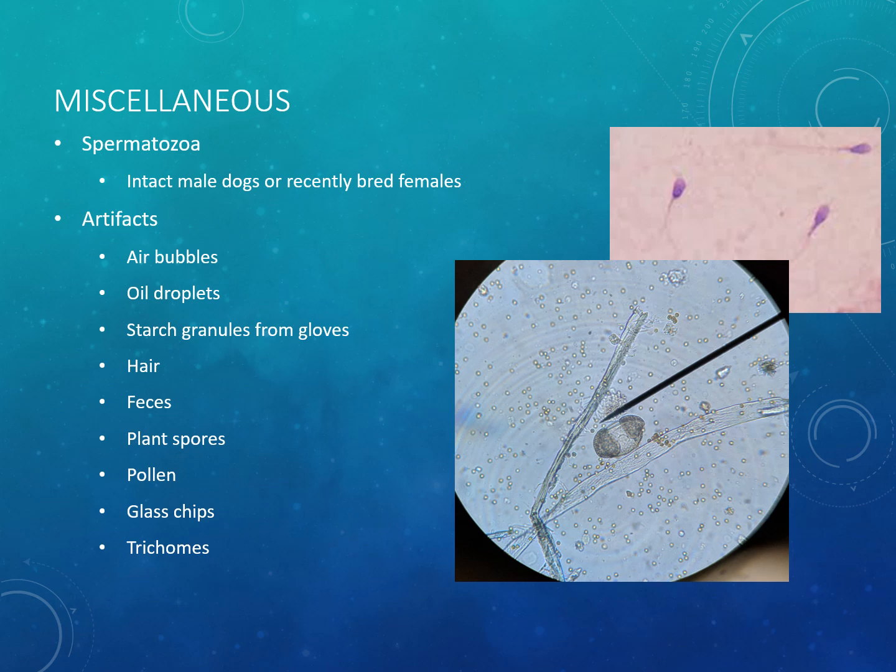Pollen, if you look right here, we have some sperm. We have some fibers, possibly fabric. We have some plant material here. This right here is pollen. This little Mickey Mouse looking thing, as we call it, is a species of pollen that's very common in urine. And if you look at this urine, it's filled with red blood cells as well.